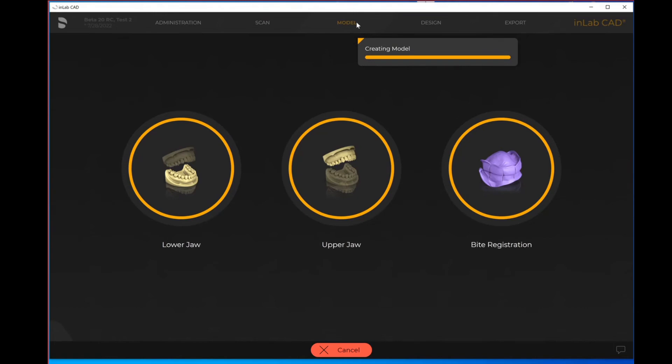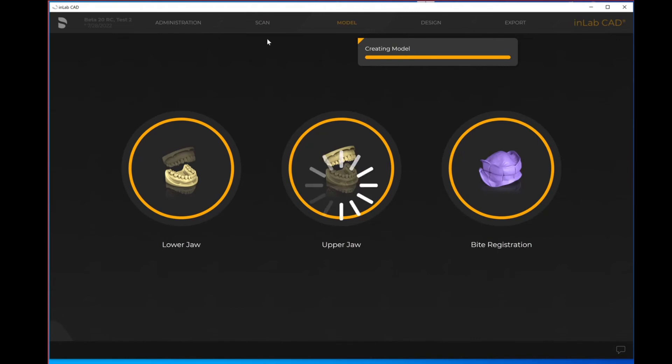I did just want to showcase to you one more additional item. Once you do get into the model step, that is also the step where you are able to export STL files or other file types. I always recommend getting to the model phase as a minimum before you try to export your STL files. When you are in the scan step you can't directly export from there because at this point in time those STLs are still considered just raw data. You do want to get to at least the model stage because at that point in time they've now created 3D renderings of those STL files, so it is a full file format which is available to export accordingly.